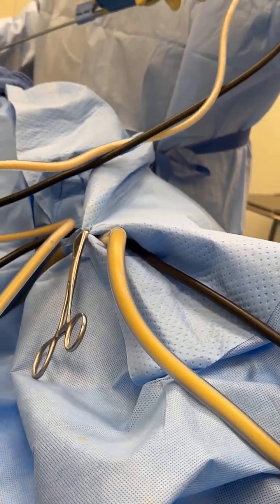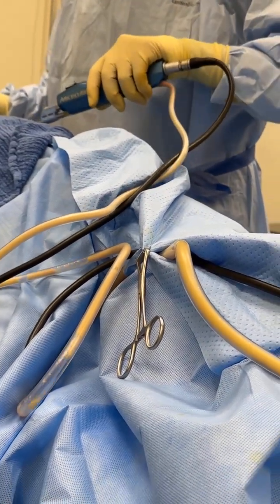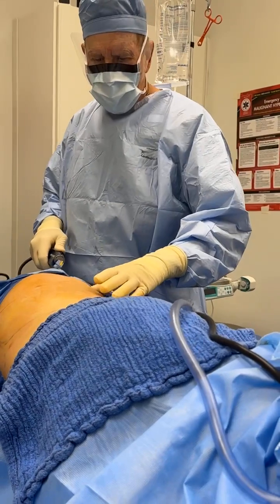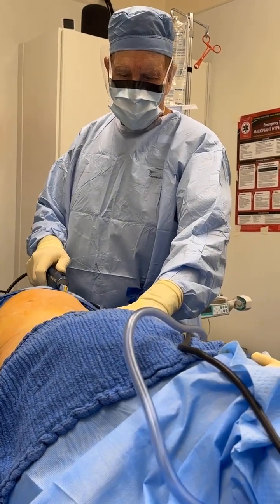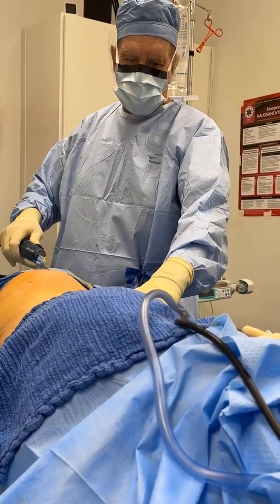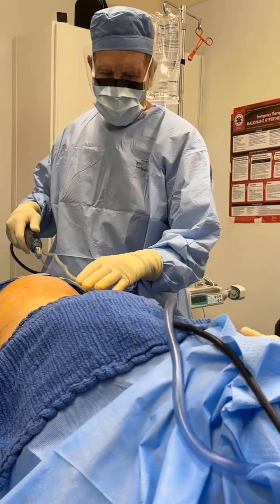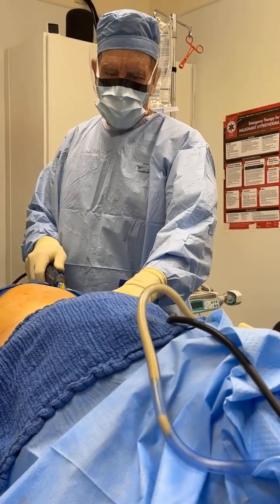Proper anesthesia — we use tumescent anesthesia to do this procedure, and it's incredible. Like an electric toothbrush: if you have one, you don't have to go at it. You can just let the tool do its work, and that's basically what I do here. I let the tool do its work. But some surgeons have the electric toothbrush and go at it anyway — if you do that, it defeats the purpose and you're going to have bleeding. If you want to learn to do this procedure in a bloodless manner, please follow along.